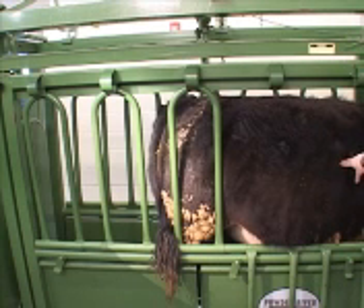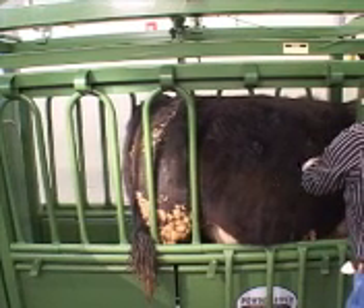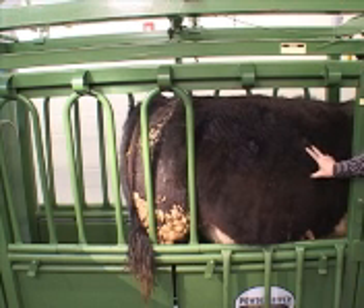Okay, there's the third rib space. You're going to come a third of the way down the back, so about right here, I'm going to clip about a four-inch-wide square right at that space.